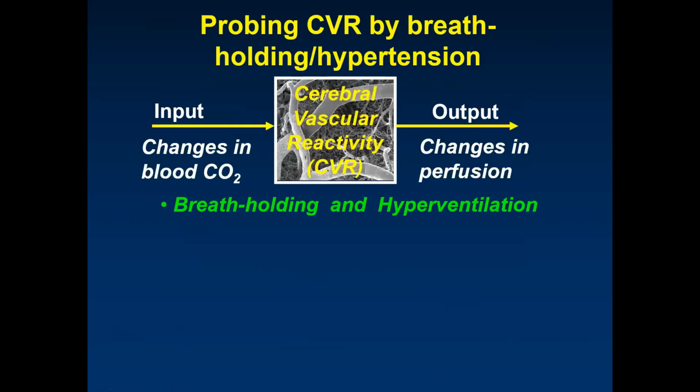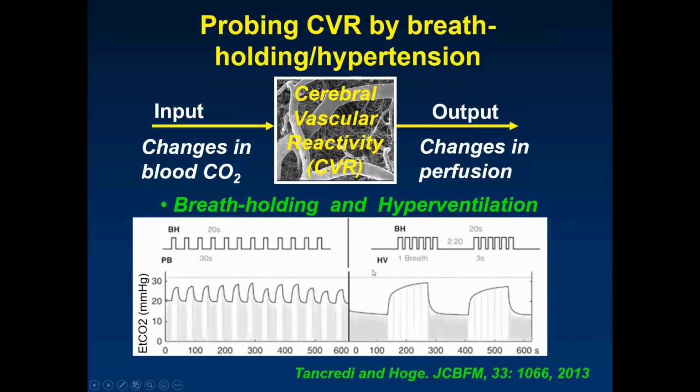And the answer is yes. And the conventional way to measure CVR without gas challenges is using either breath holding or hyperventilation to change blood CO2. And shown here are example diagrams of breath holding and also hyperventilation.